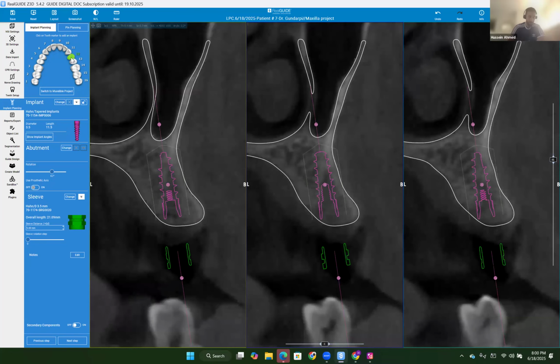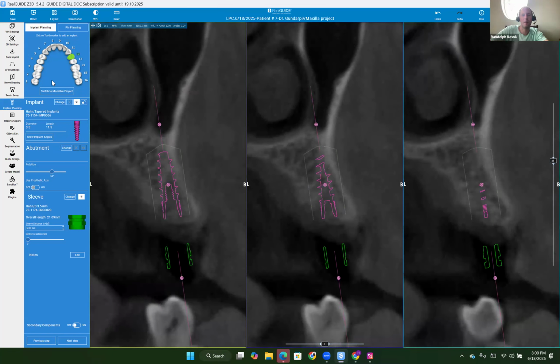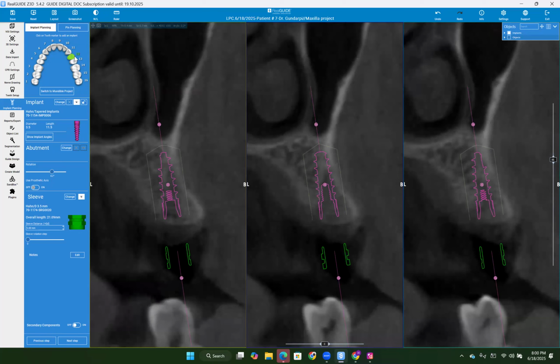And what are your thoughts, Doc? That looks perfect. This case couldn't be more of a home run. Get this patient scheduled tomorrow morning. This one's perfect. Have you placed a lot of implants? About 20, 25. Have you done them guided or freehand? Always guided. You like the guided? It makes it easy so far. This one guided, perfect. They have great bone. This one's a slam dunk.